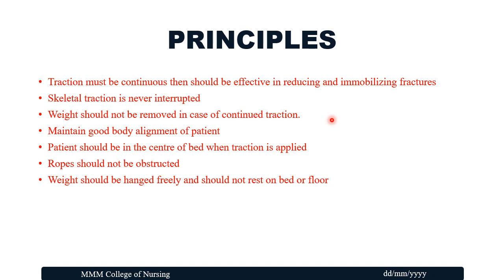We must also keep in mind to maintain a good body alignment of the patient. The patient should be in the center of the bed when traction is applied. Ropes should not be obstructed. Weight should hang freely and should not be resting on the bed or floor.